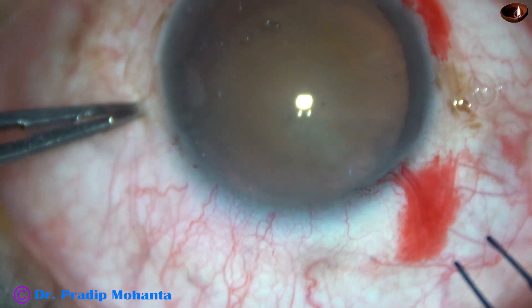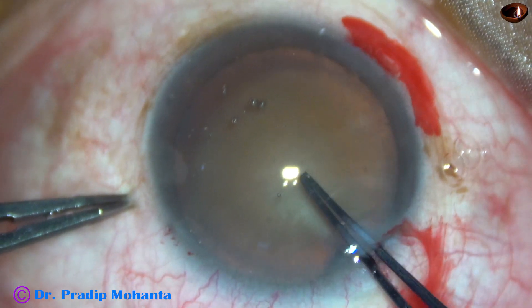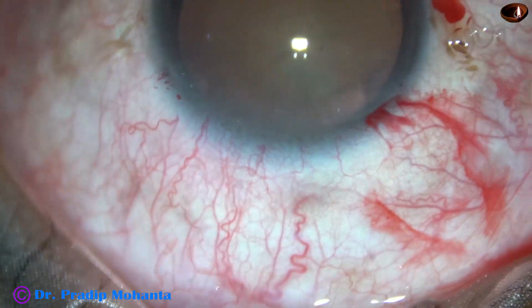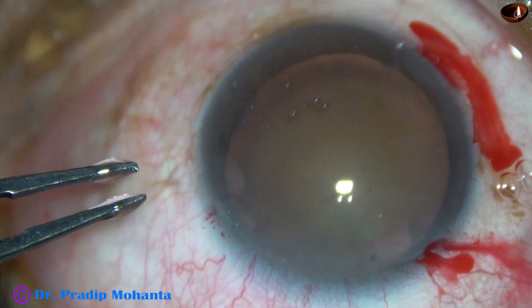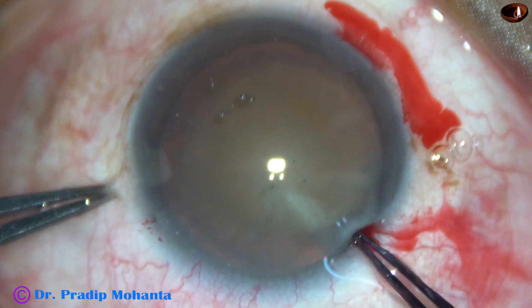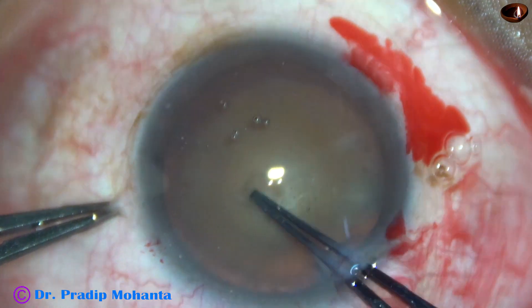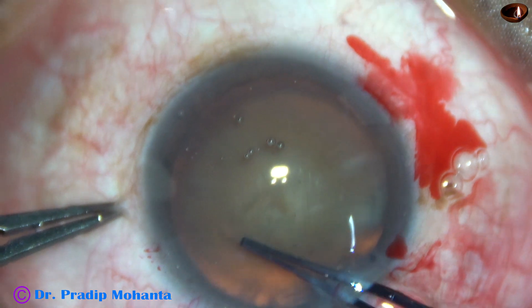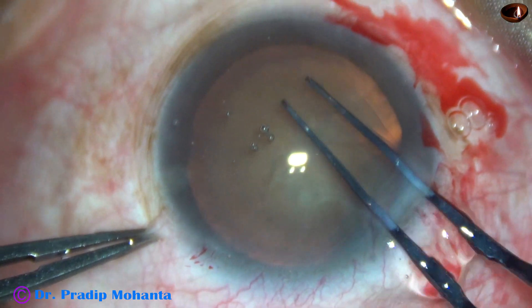Capsulorhexis. A capsular tag is raised and this capsular tag is guided anticlockwise.